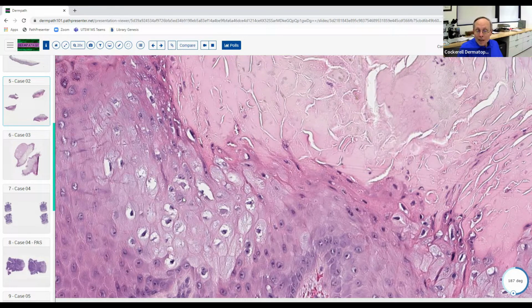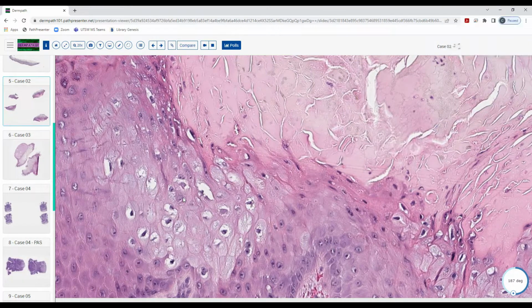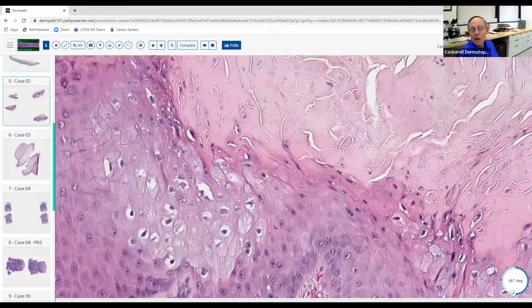So you said ORF, what type of virus is that known as? What family does that fall into? This is a very timely biopsy for you guys to be looking at right now. Oh my gosh, I can't remember. Yeah, it's the poxvirus family, parapoxvirus. And so what's our big virus that we're all worried about right now in the United States and the world?